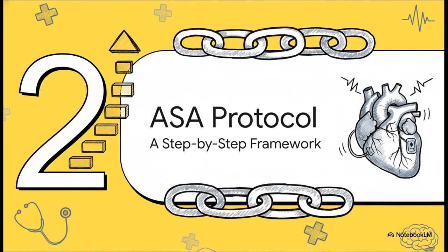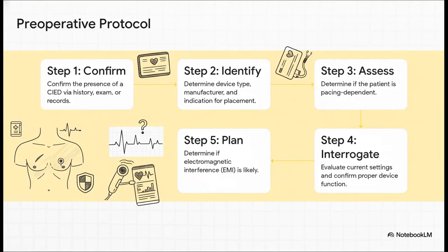So, we've got the basics down. Now, let's build on that and walk through the official framework we should all be using. The American Society of Anesthesiologists Protocol for Managing These Patients. This is our playbook. The work here starts way before the patient even hits the OR.